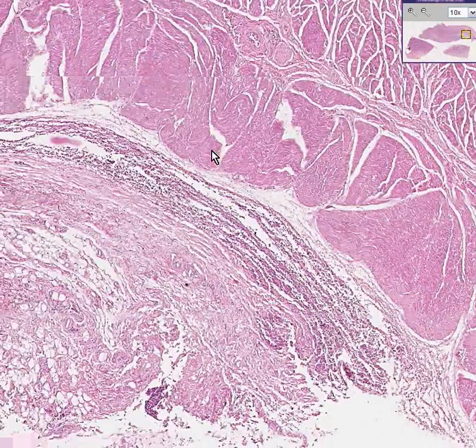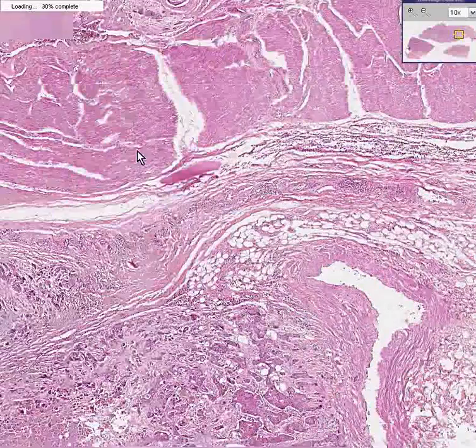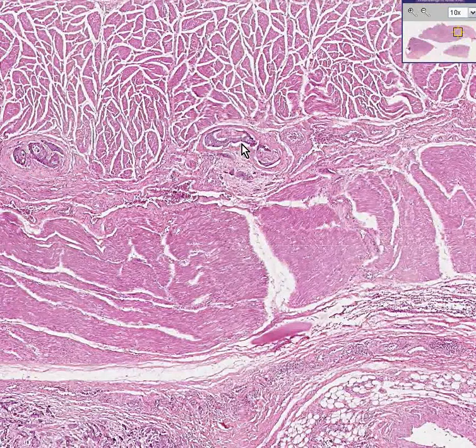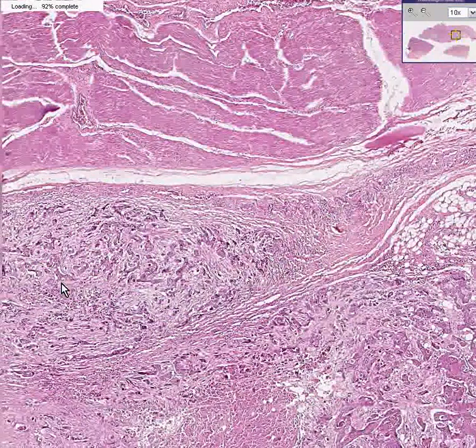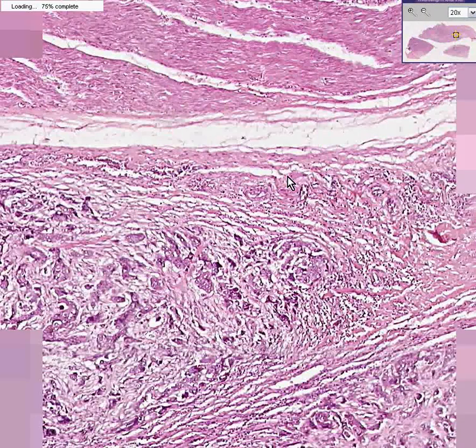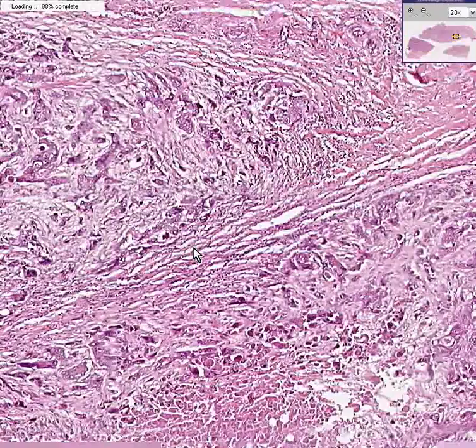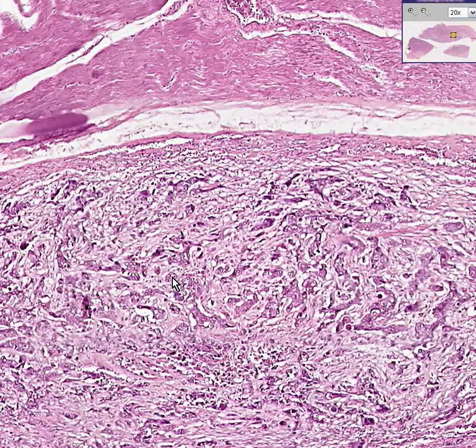You can see a lot of inflammation, but what you could mostly see in this case is that all throughout the submucosa — a nest here, a nest here, here, here, here — and even beyond the muscular layer, you can see these irregular nests of cells which have all the features of infiltrating squamous cell carcinoma.